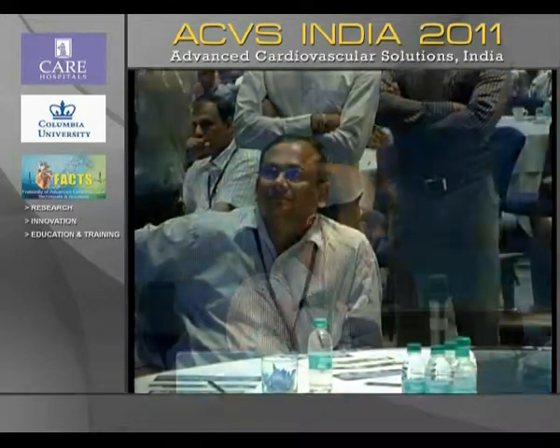Probably those were the limits. Is it because you did not get a 4 millimeter covered stent? Was it not available? Not available. Normally we get sizes of 3 and 3.5. Actually, I feel luckily 4 was not available. If 4 was available, you would have gone into more serious trouble actually. Thank you.